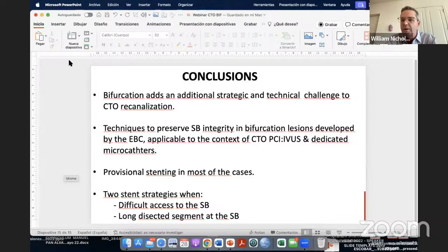Do you use cutting balloons? Do you try to just macerate the tissue so that you can develop a confluent zone there that you can treat, or do you go back with a sharp tapered wire and try to puncture through that flap upstream a little bit to be able to use your other wire as a marker to understand where you're going? Have you had any good advice for us on how to do that?